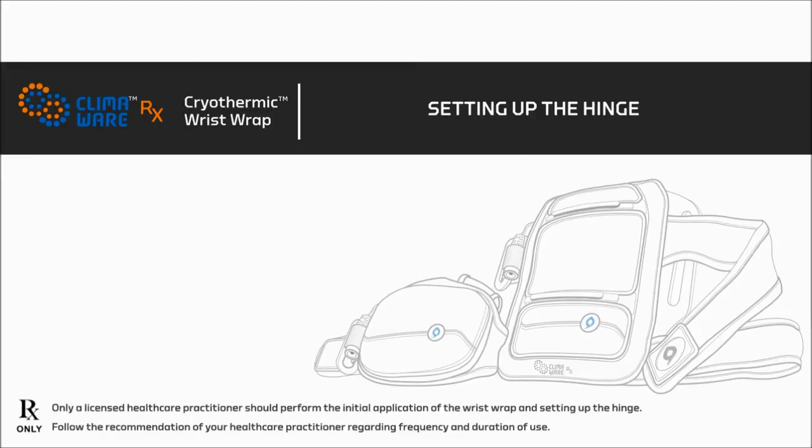Now we will discuss setting up the hinge. Only a licensed healthcare practitioner should perform the initial application of the wrist wrap and setting up the hinge. Follow the recommendation of your healthcare practitioner regarding the frequency and duration of use.